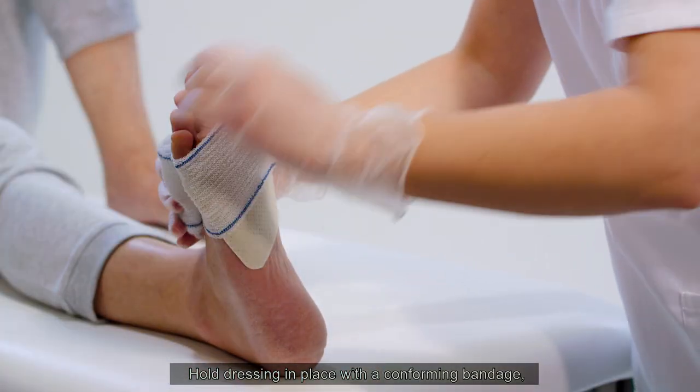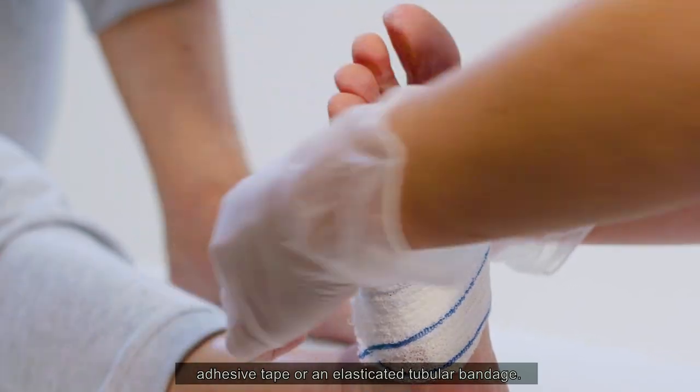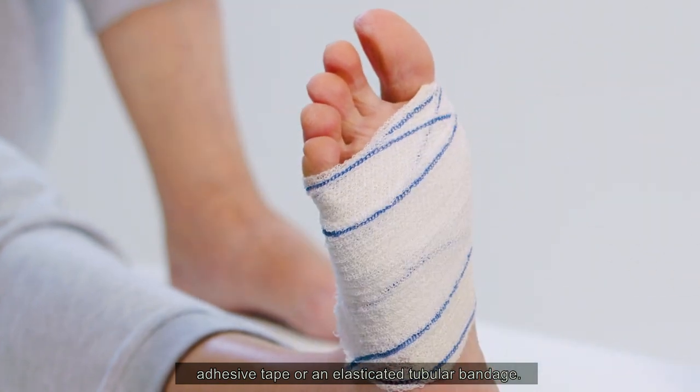Hold dressing in place with a conforming bandage, adhesive tape, or an elasticated tubular bandage.